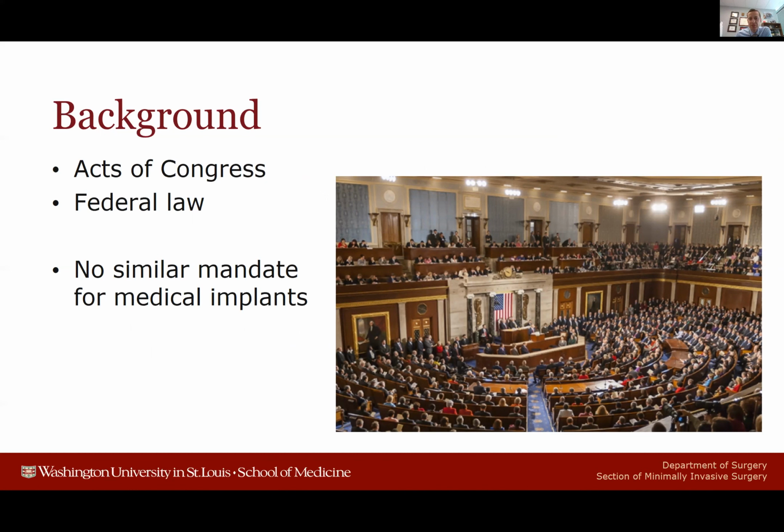And the challenge is there are really no similar mandates that apply to medical implants. So when you get a piece of suture or mesh, there's nothing that standardizes or mandates how that product is labeled in a standardized fashion.